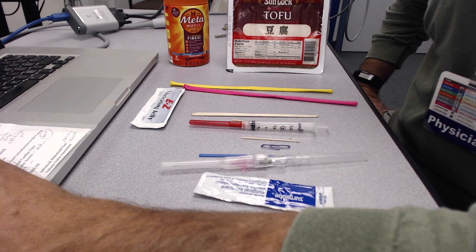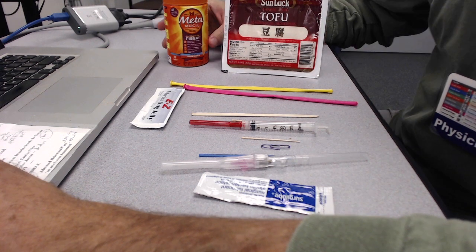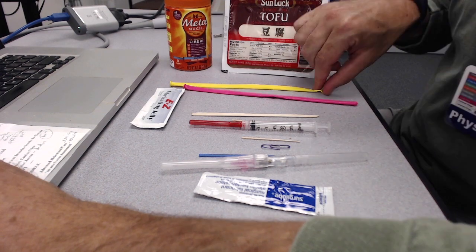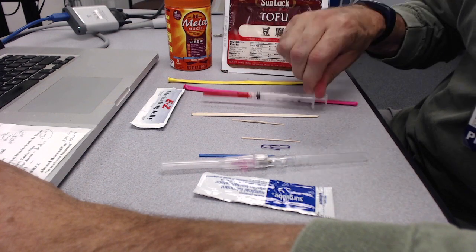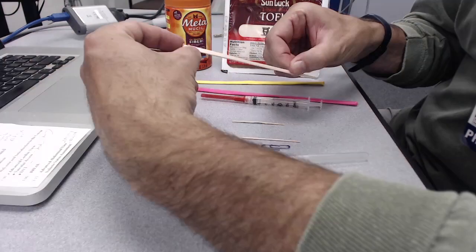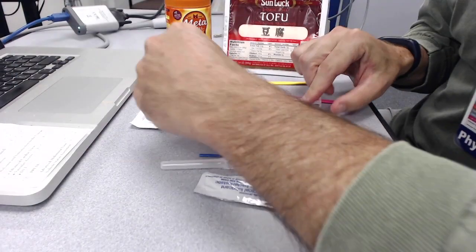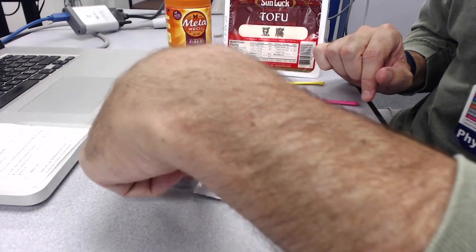Here's some of the supplies you're going to need. Just pick up some extra firm tofu, also some psyllium fiber or Metamucil, some long balloons, and a syringe from the hospital. You need a blunted stick to push the balloons through the tofu — I just used a tongue depressor — and then a toothpick or a paper clip to use as a foreign body.